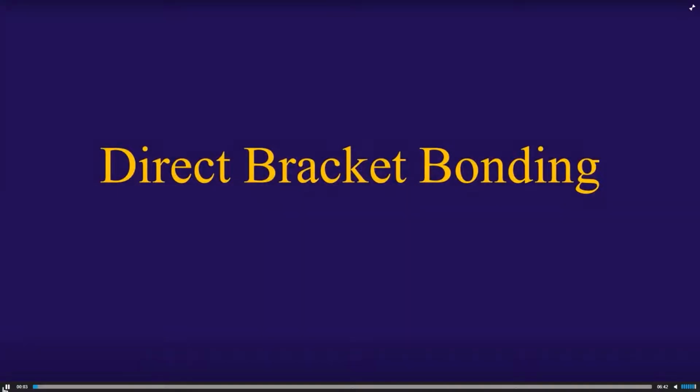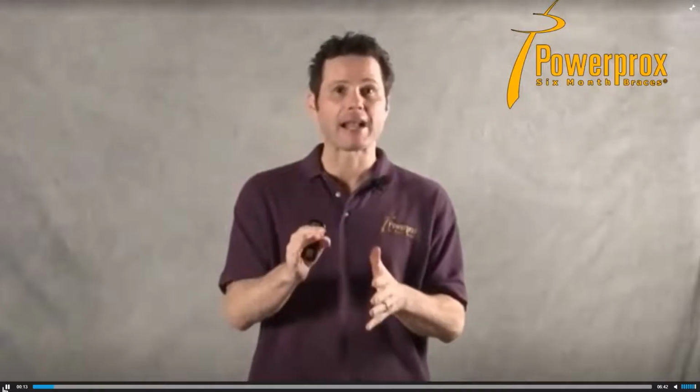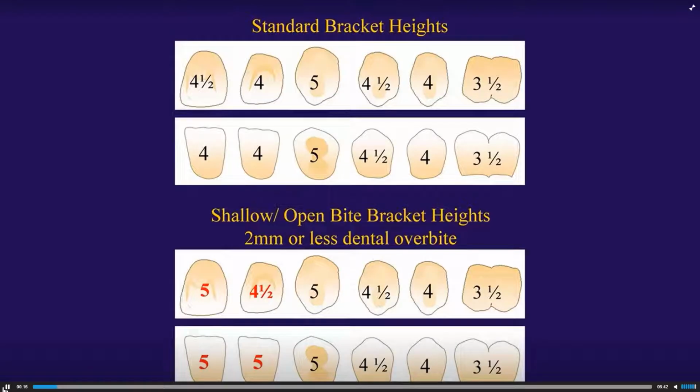Okay, now let's talk about direct bracket bonding. Even if you choose indirect bracket bonding for your initial bracket placement, you still need to know how to directly bond brackets. Now, our standard bracket heights are shown above, and we have our bracket heights for shallow and open bite cases shown below.